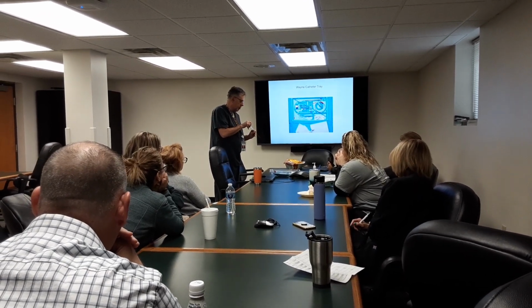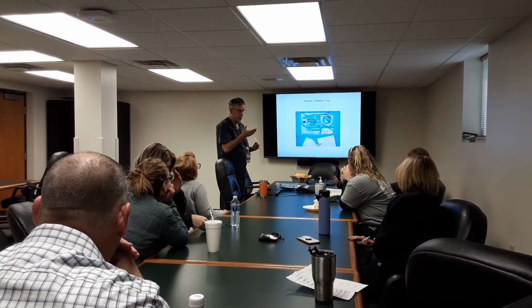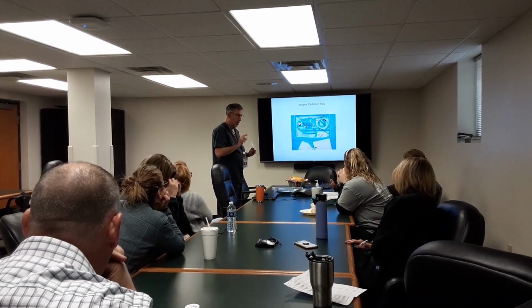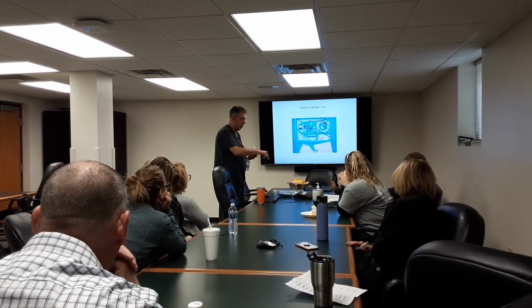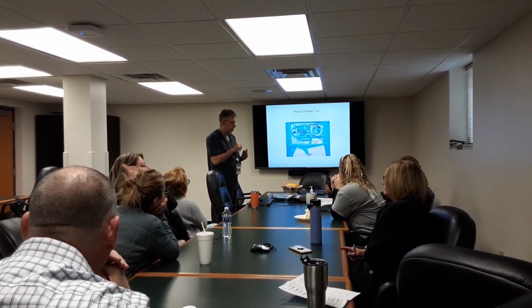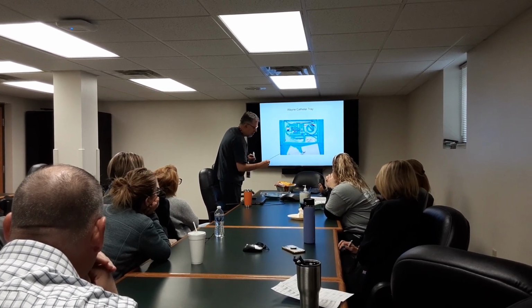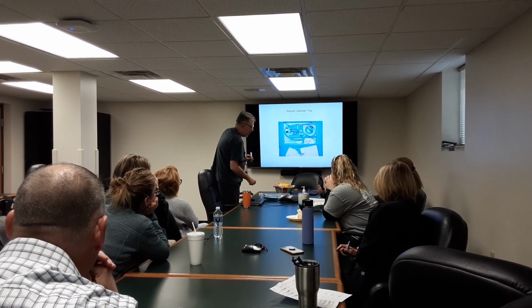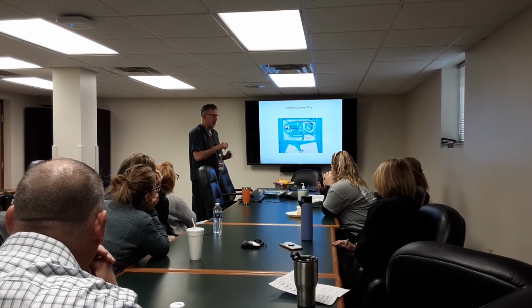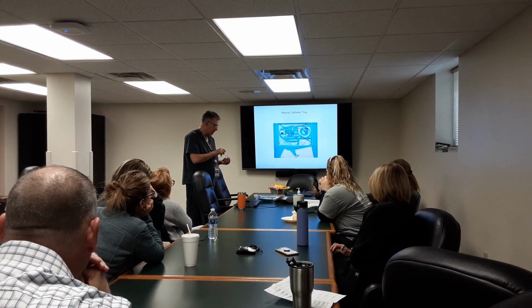You go down, so you're typically going, and this is different than a chest tube. With a chest tube, you're going to go 1 interspace below, and then try to get it to tunnel up into the interspace above where you put the tube itself. That's not what you're doing here. Here we're directly accessing this, because when something this size is out, it's unlikely that it's going to have a problem with creating a pneumothorax from having it removed, and all that soft tissue will close in front of it. So anyway, yeah, you're going right in.